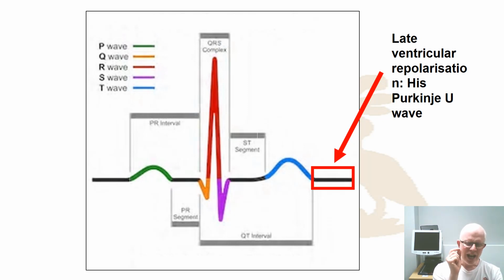And so you can see how the ECG can be used to identify, if these responses looked abnormal, we'd be able to make good determinations about what's going on at the heart, because we understand how each of these relates to different components of the heart and different time domains of the heart.